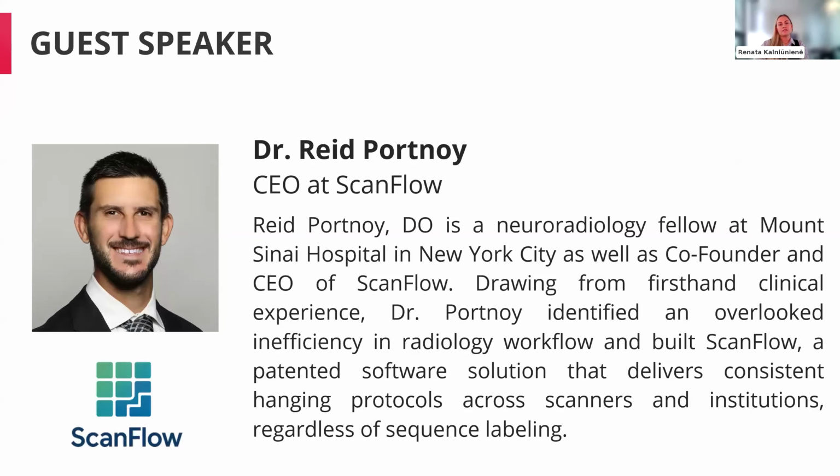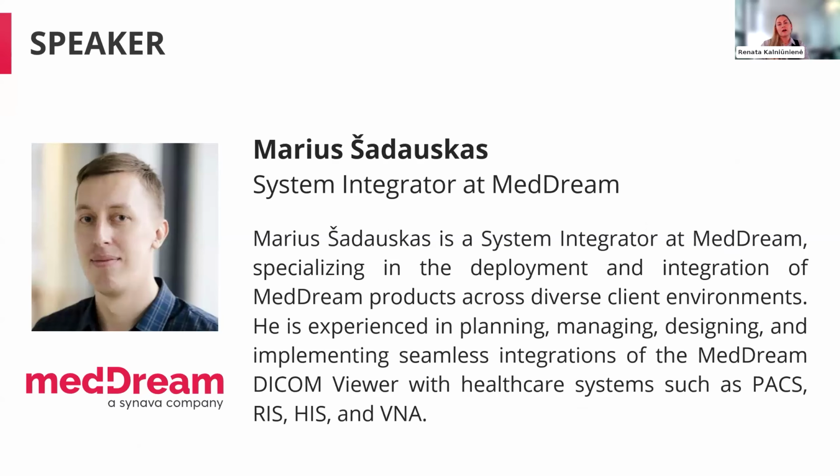As I mentioned, our guest speaker is Dr. Reid Portnoy, CEO and co-founder of ScanFlow. He is going to tell more about himself in his presentation. Also, my colleague Marius Šadauskas, who is always a part of our integration webinars, is going to introduce this collaboration and help in the question and answer section. So Marius, please go ahead and introduce our partners for today's webinar.